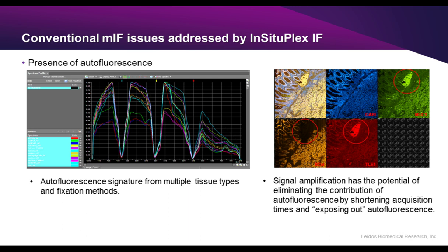I'd say where you want to run multiple markers in a high multiplex situation is when you have specific questions on these relationships between the markers you're looking for. Do you really need to look at spatial relationships, say PD-L1 tumor cells and the tumor microenvironment, CD8 cells, etc., adjacent to? Are you looking at relationships between CD31 stained blood vessels and other targets? That's when you start wanting to stack the data on each other.